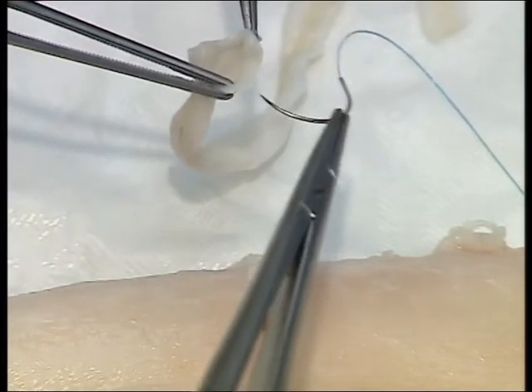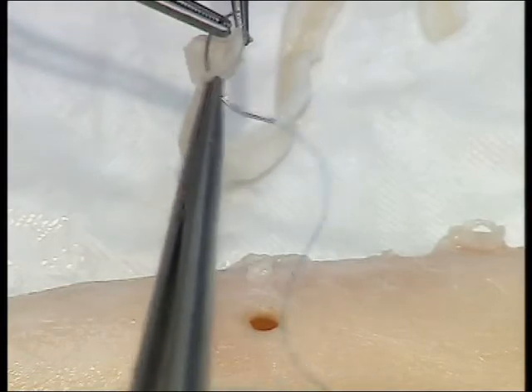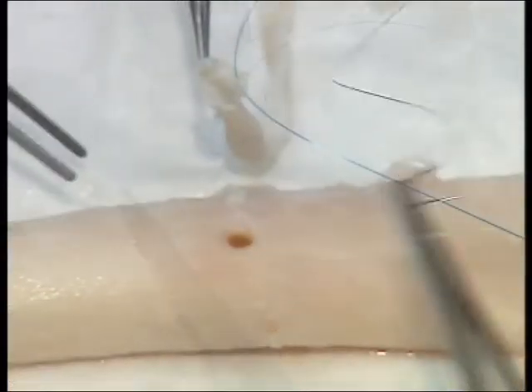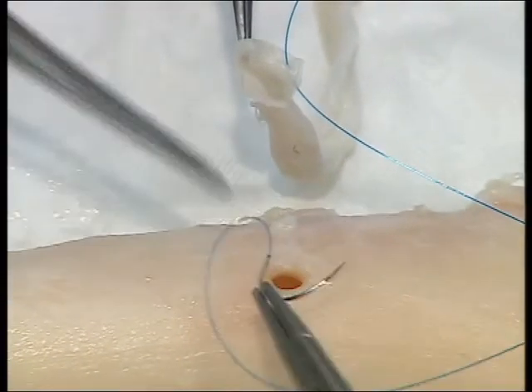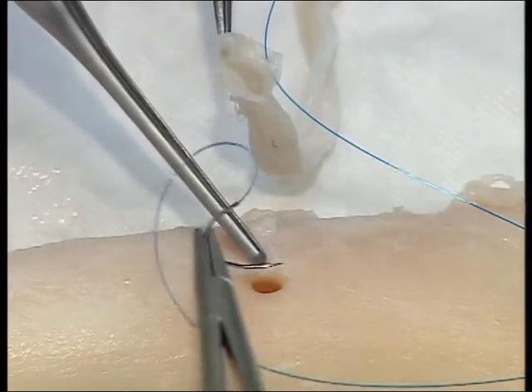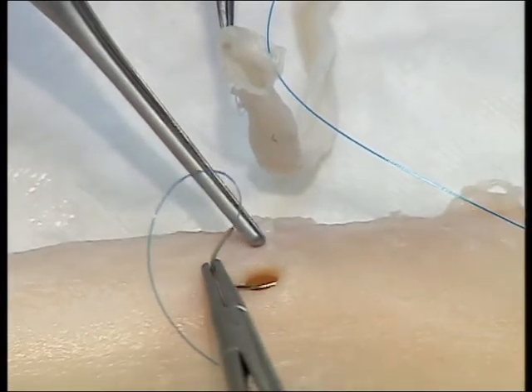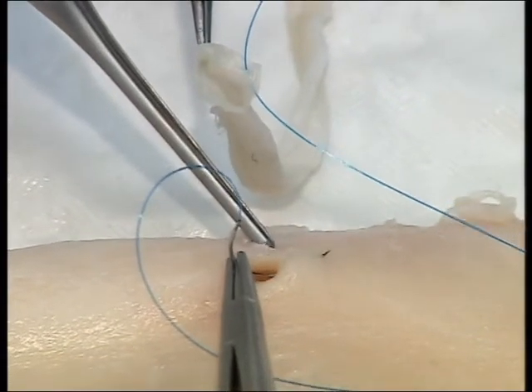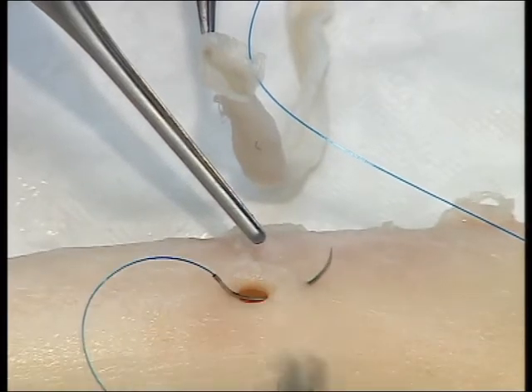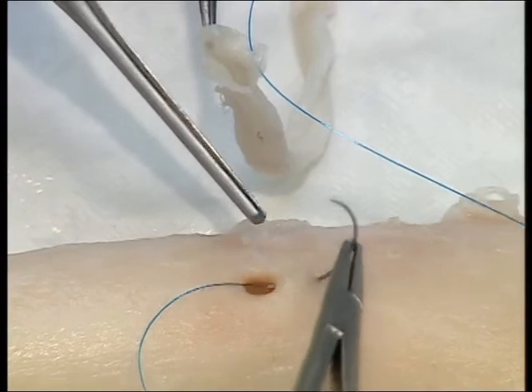Starting approximately halfway along the conduit, pass the stitch from outside to inside, and then from inside the aorta to outside at the 3 o'clock position, as if you were looking at a clock face.